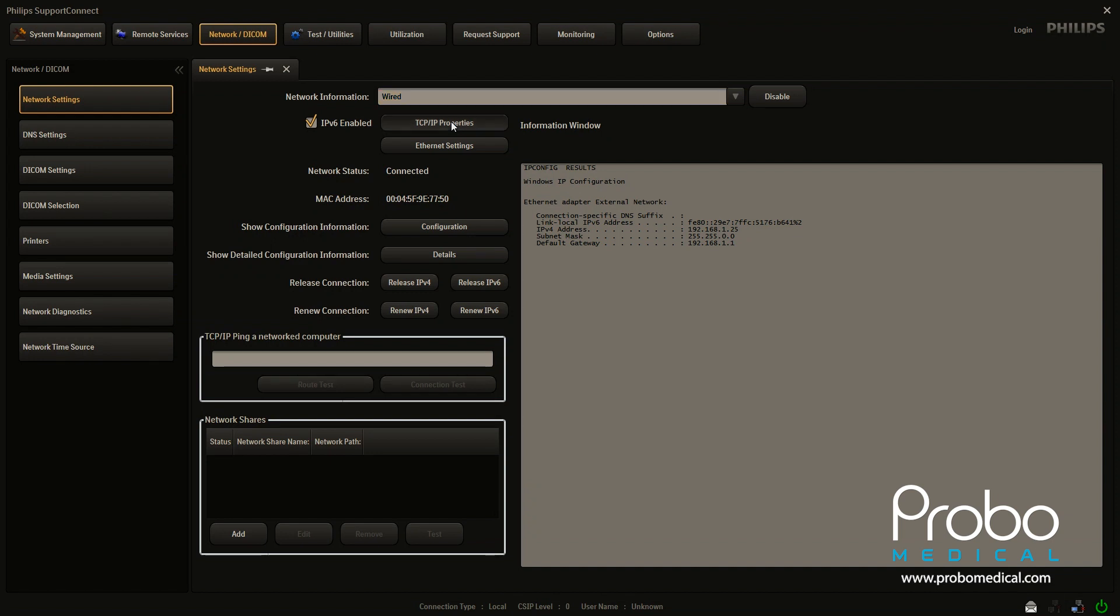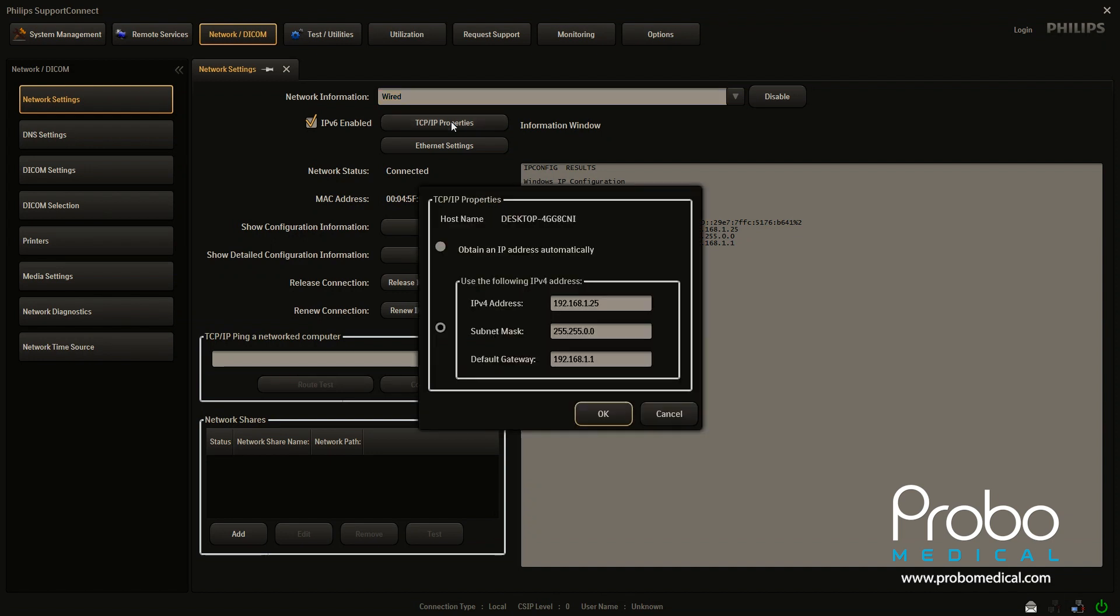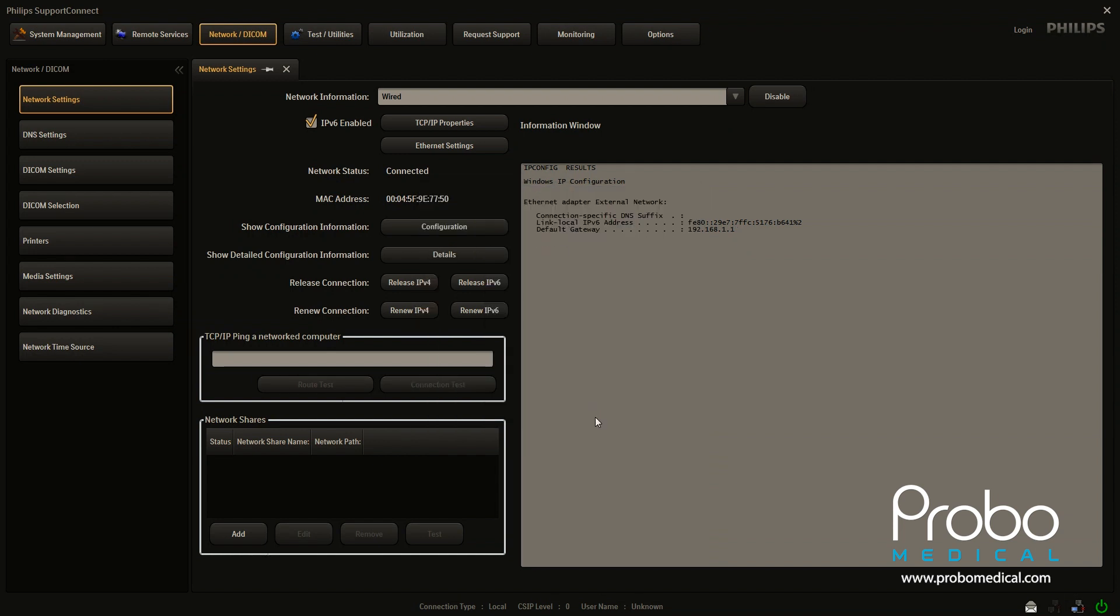So we're going to go to TCP IP properties. I already have an address entered for us. If you want to use dynamic, that's up to your facility and whether or not dynamic is going to work with your particular PAX product. Go ahead and enter the IP address or click obtain automatically for dynamic and click OK.